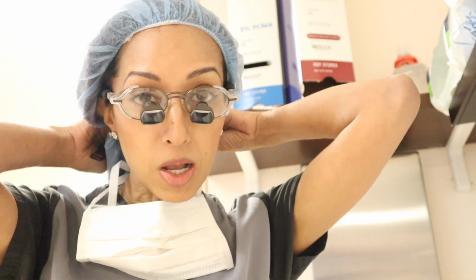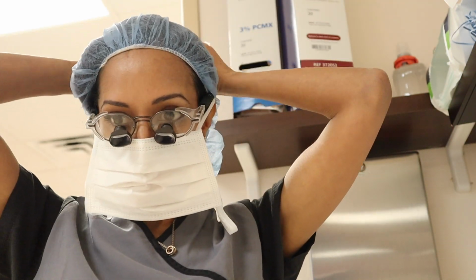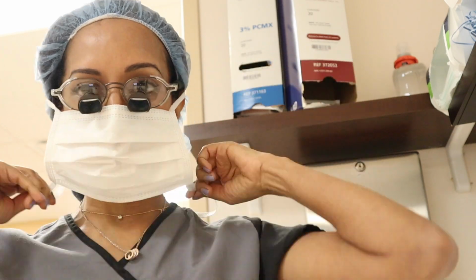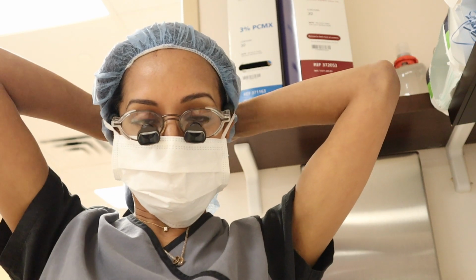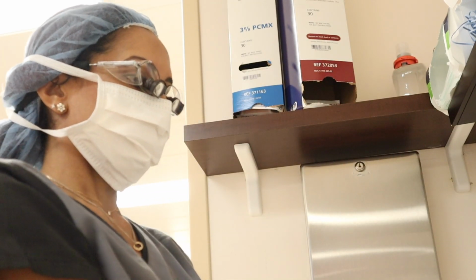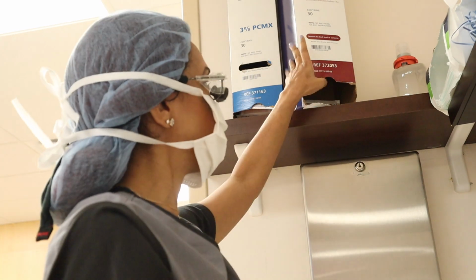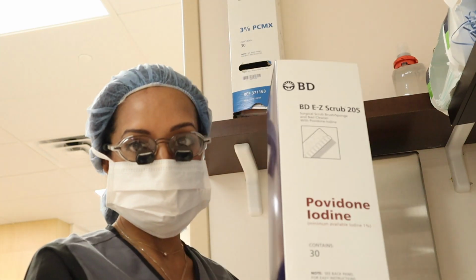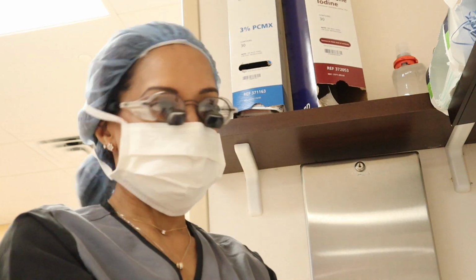These are my loupes. This is what I need for strabismus surgery, so that I can see the small passes that I make in the sclera. So you need to adjust everything before scrubbing. Make sure your focus is right. This is tight, everything. I'm going to do a waterless scrub. The first surgery of the day, I always use one of these betadine kind of things with the brush, and I like that for my first one. And then after, I always do a waterless.